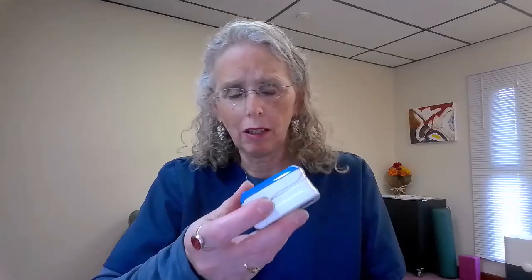Most of the time they are, like 99% of the time, but every so often you'll run into a patient and it's low. You want to have that information and then ask more questions about history, about any asthma or anything like that, especially if you see it consistently. Of course, sometimes you'll get readings that are a bit off, and that's probably because your battery is low. So check it on yourself first, and also check your batteries. But you do always want to make sure that there's enough oxygen in their blood. Okay, so that's why I use that.